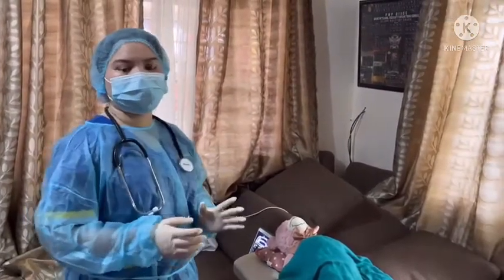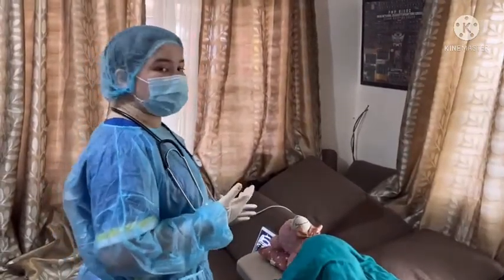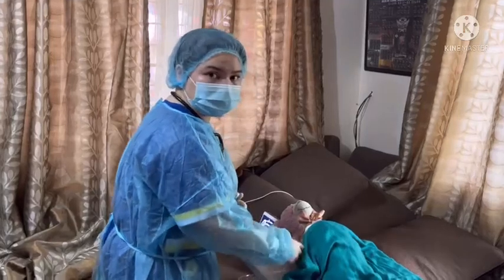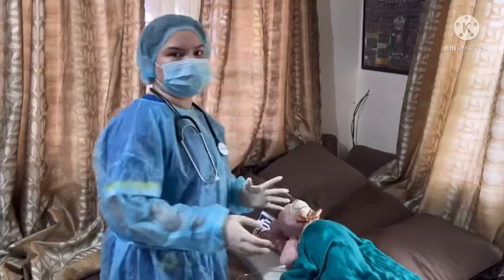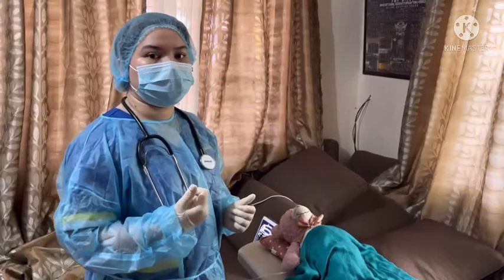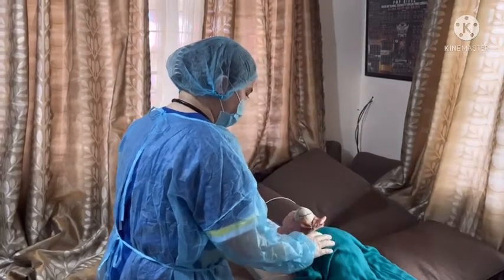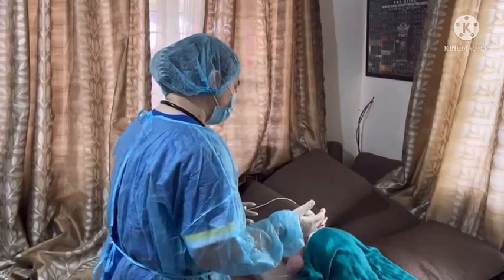Identify your patient using two identifiers: get the patient's name and birthday. Ma'am, may I know your name and birthday? Then check her band name. When we have the right client, let's now explain the procedure. Ma'am, I'm going to check your chest tube, and then I'm going to check if there's any drainage.